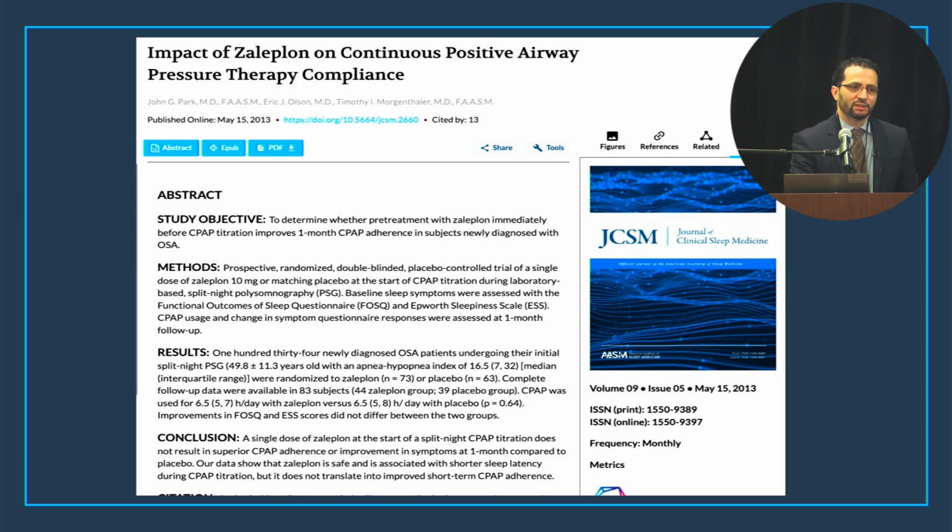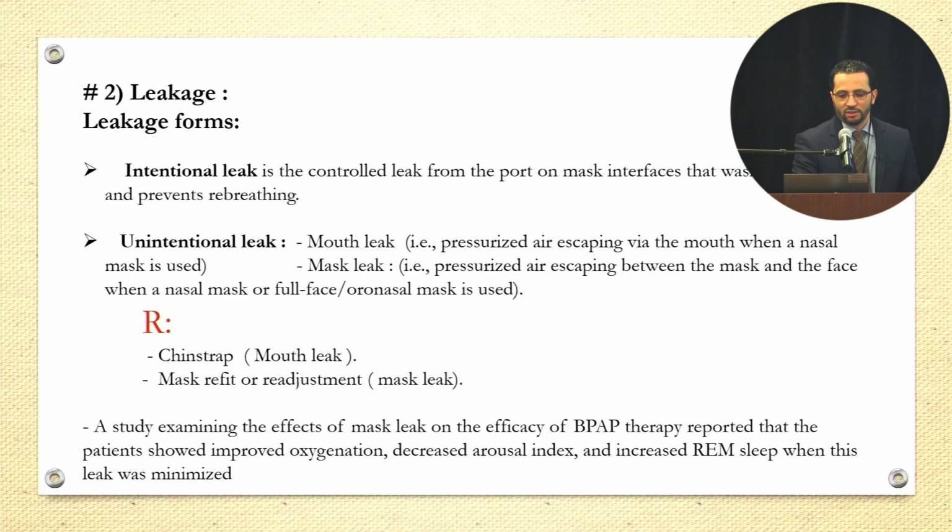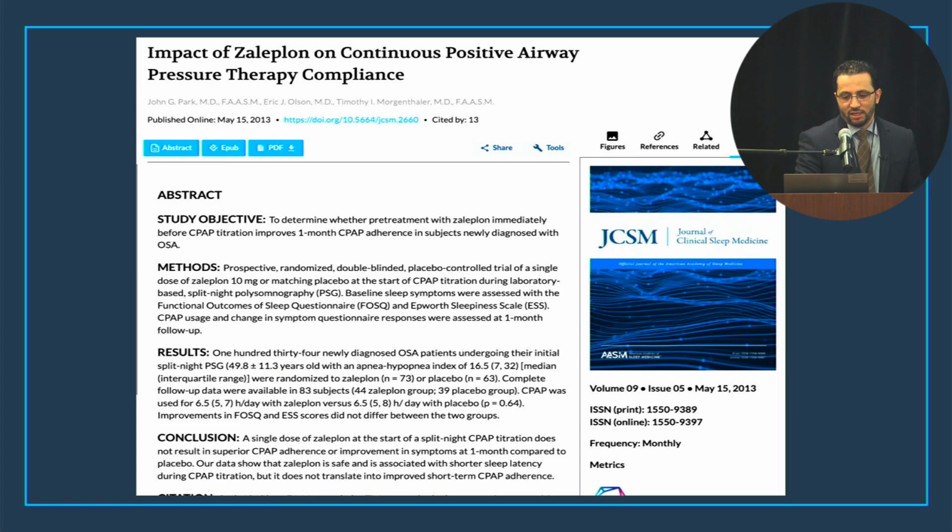And for older patients, I'm always on call for those to try to judge the risk versus the benefit. If the patient won't sleep and he is 65 or older, you need to talk to your on-call doctor and come up with recommendations about should we do it, should we not. You need to make sure that you have at least 7 hours of sleep before. The patient needs to have a ride next day, and all of that is for the patient's safety. So this is number one, insomnia.